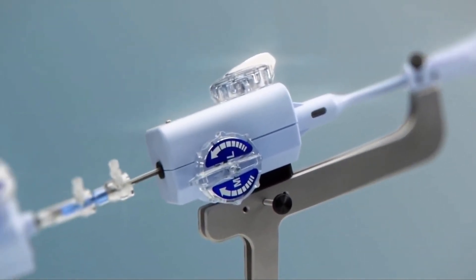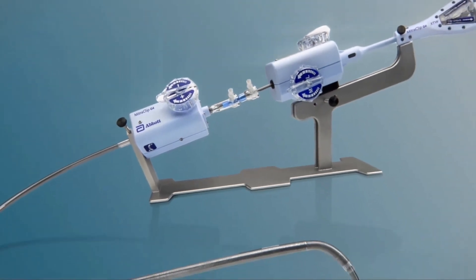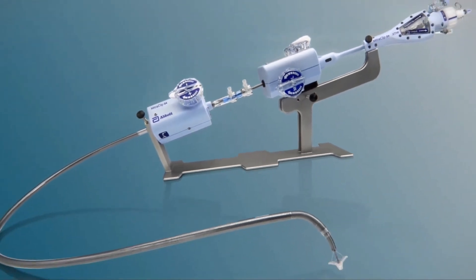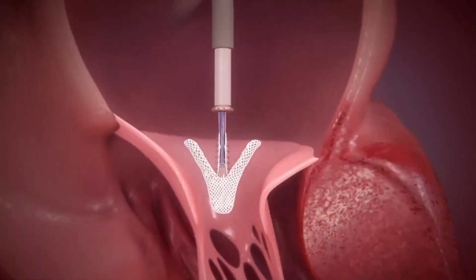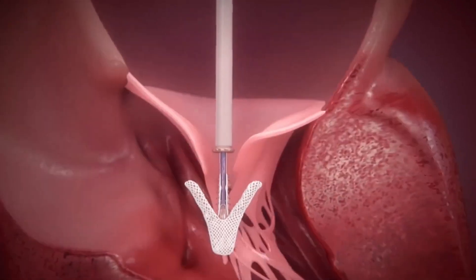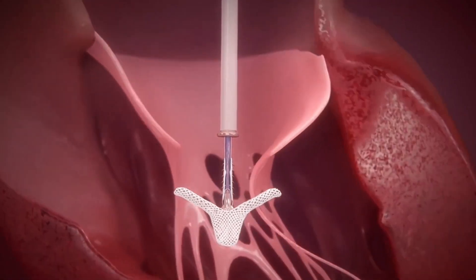This is the device — this is the clip. It's at the very end, and that's what we're going to use to bring those leaflets together. It has a lot of knobs and definitely takes a while to get used to, but it's actually been a really brilliant device for certain patients to treat their regurgitation.